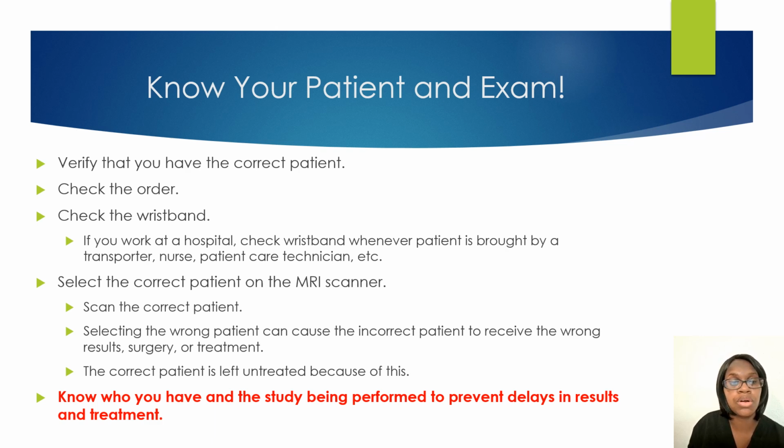You want to check the order, make sure you are performing the right exam, such as if you know a patient is coming in for headaches, but the order states the patient is coming in for their right foot, that should be a red flag right there. You want to check with the patient to verify which exam is being done. If you work in a hospital or if you work at a clinic that has wristbands, check the patient's wristband along with their order and the name as well.